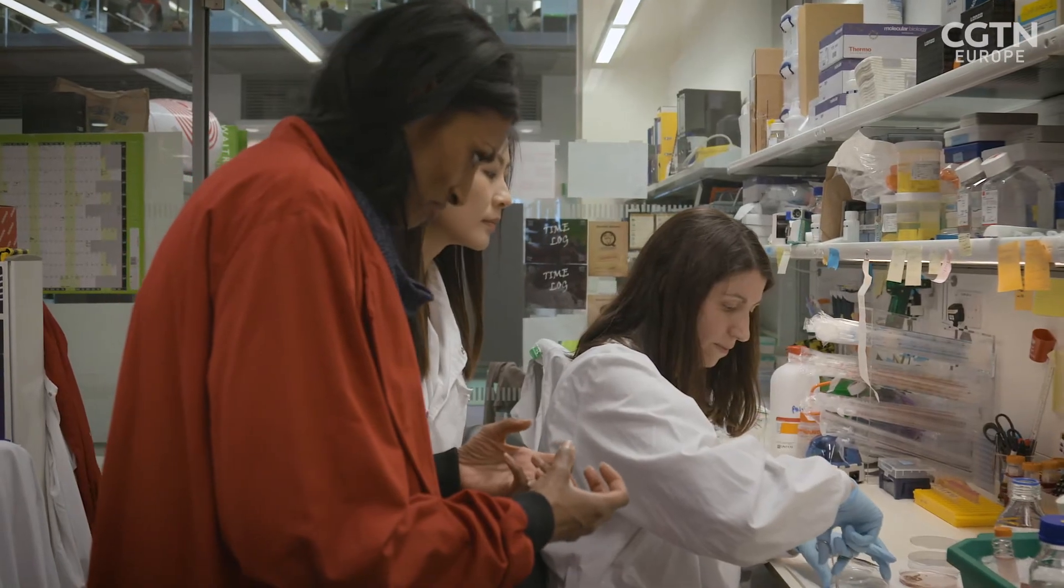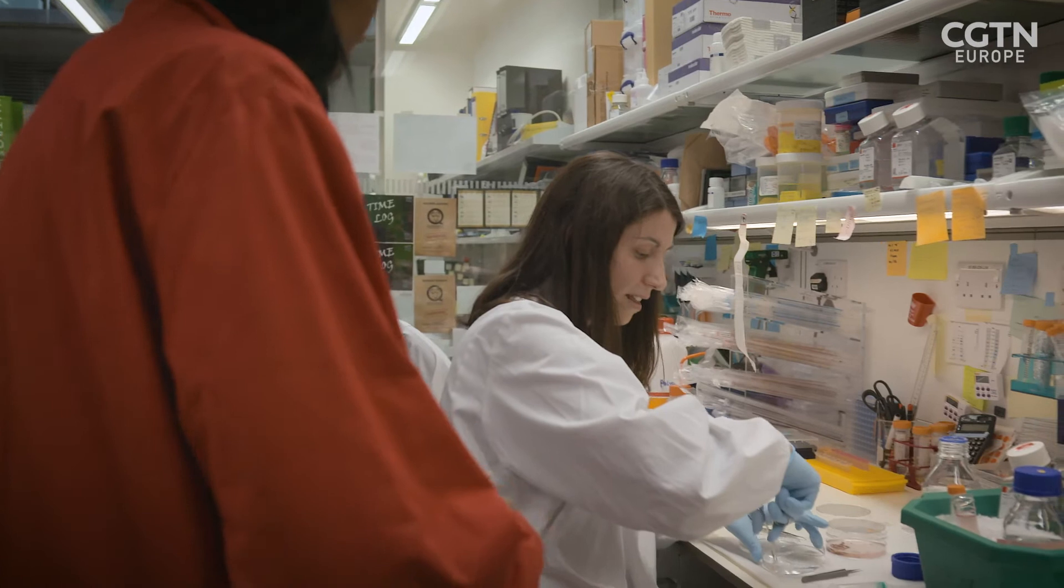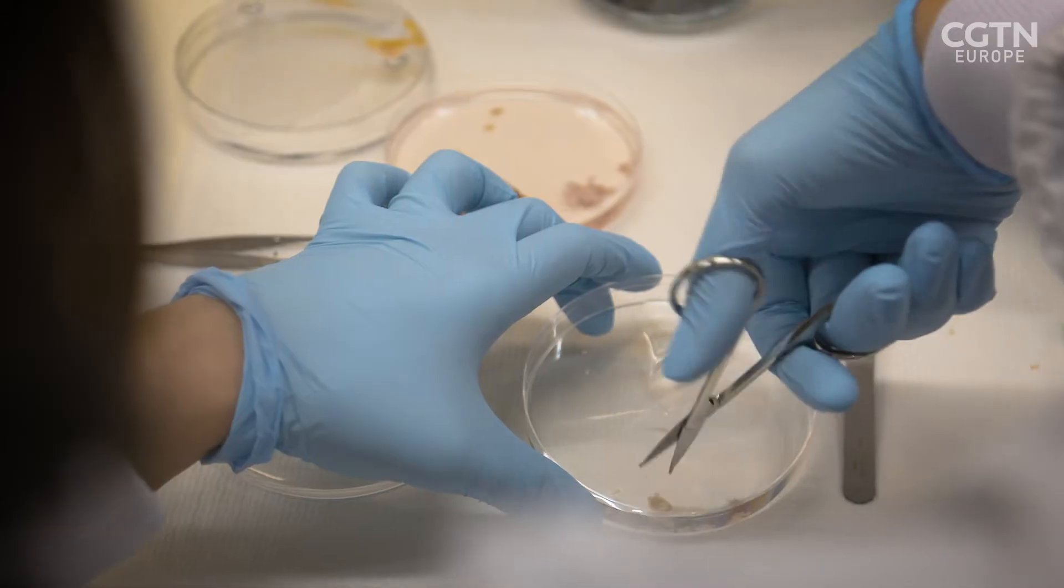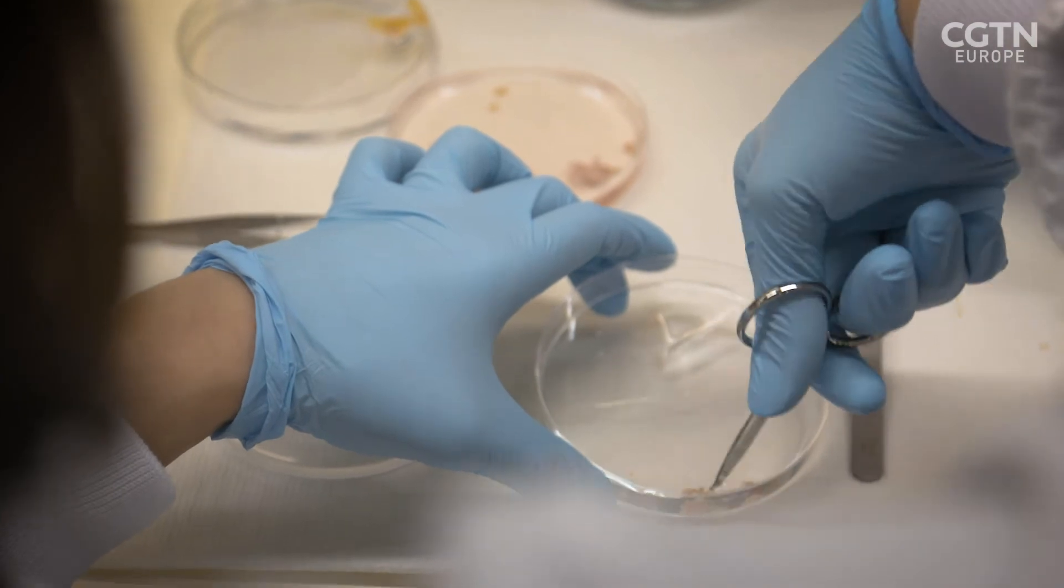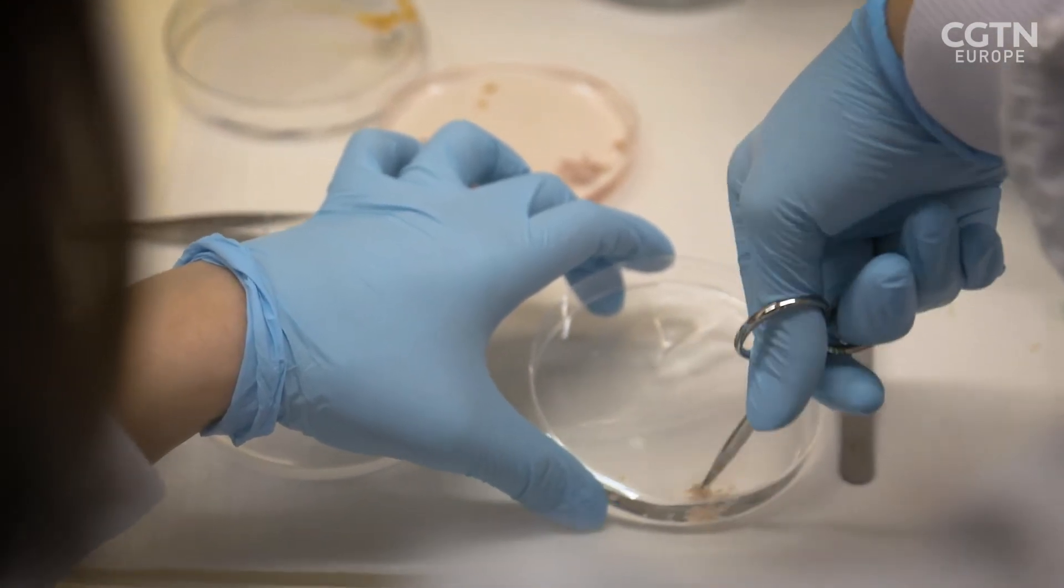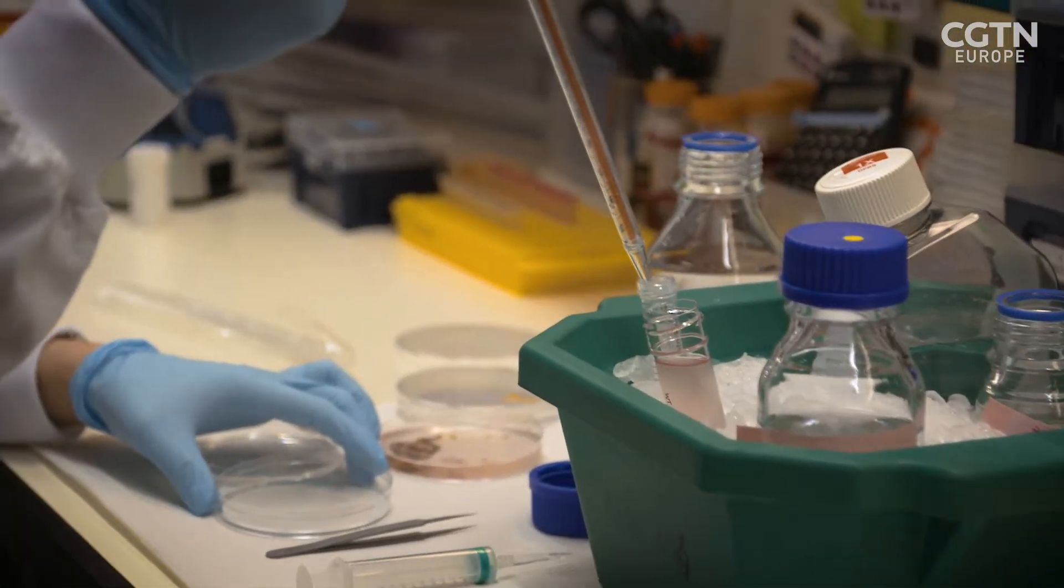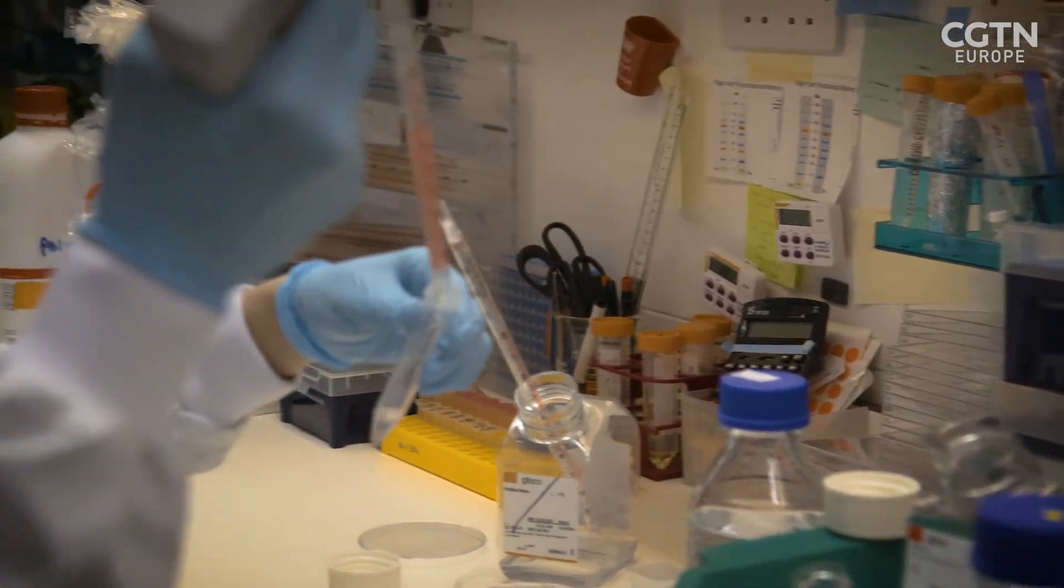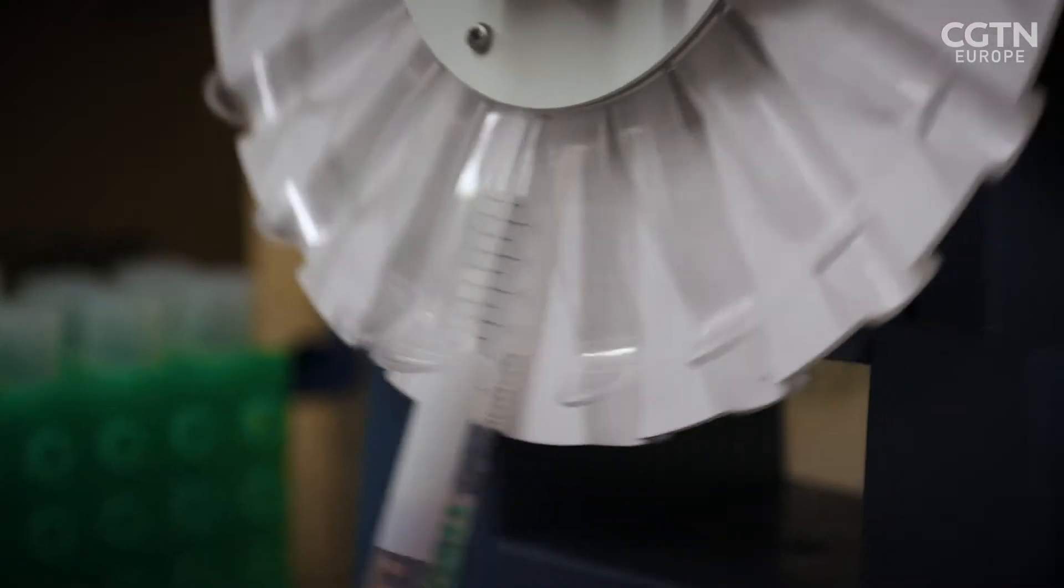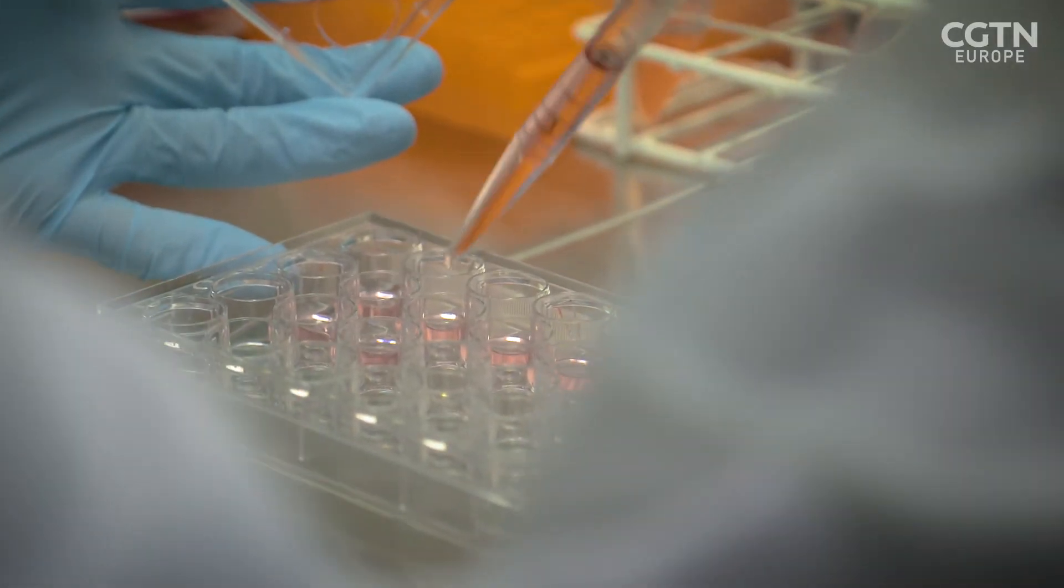You are doing that so that you can grow them further? Exactly. You can maintain them in culture and it's a great model just to study a lot of things. After the mouse gut is dissected into small pieces, they're added to a special solution to detach the stem cells. They're then collected by spinning them in a centrifuge before being added to a collagen-based gel. They are then taken to an incubator to grow into mini-guts.